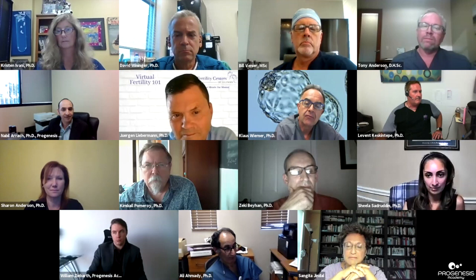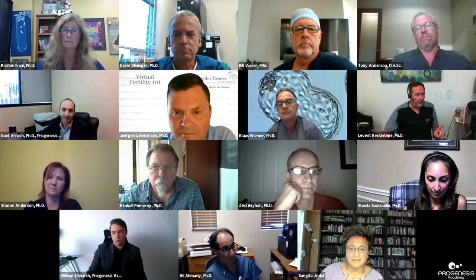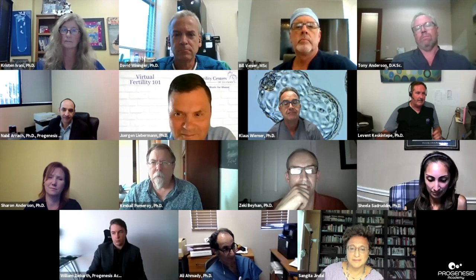That's great to know, Kristen. I've never heard anybody compare the two. And we have to hatch on day three as well. What about the amount that you hatch? I heard Levent a while ago talking about, didn't you say one third of the zona? Kim, I hatch on day four for biopsy, and the reason is that most of the time I can predict the blastulation site. But when I thaw the embryos, I cut one third of the zona after thawing, not before.